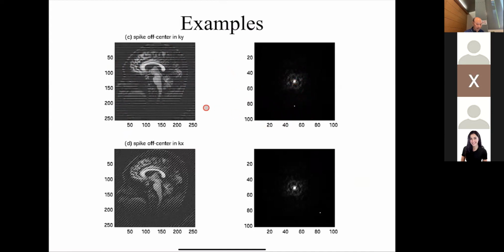But this is an important example because remember, if this is Kx and this is Ky, right? I go from the center of K-space and I can always draw a vector out to that point. And then the interference pattern is perpendicular to that vector, okay? If you're familiar with electromagnetic waves, you have the K vector, and the wave fronts are perpendicular to the K vector, right? From physics. So it's the same thing here. So if you see a point in K-space, just draw the K vector out to that, and then you know the pattern it corresponds to is perpendicular, all right? So for example, here, if it happened here, then the K vector goes this way, and you get these stripes, okay? So, yeah, that's sort of interesting.